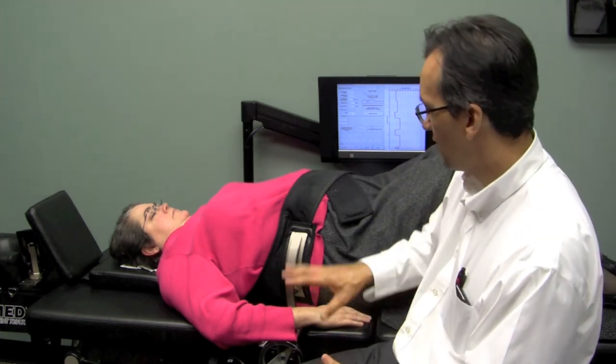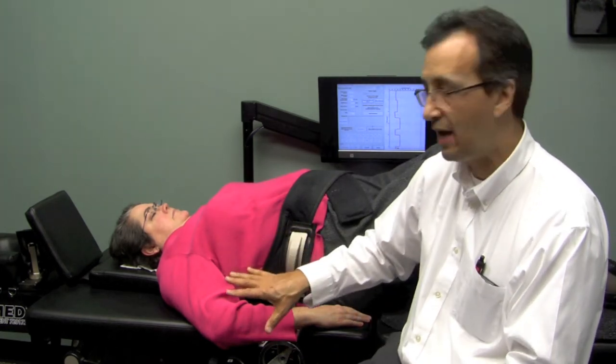There are other videos on the website that explain why — physiologically, biomechanically, and anatomically — this treatment is so effective for so many people with neck and back pain. I'll leave you to look at those other videos to understand the rationale, background, and research behind how it works. But I wanted you to get a chance mechanically to see how it works.